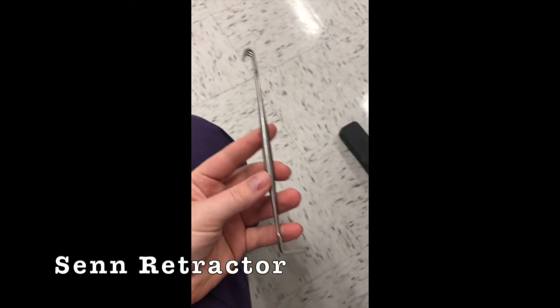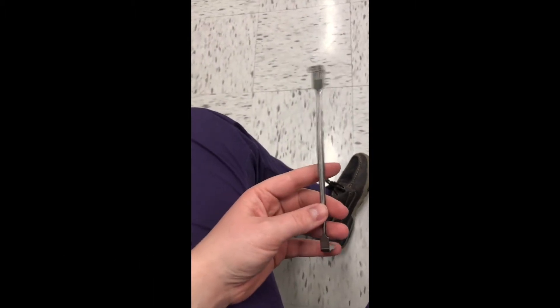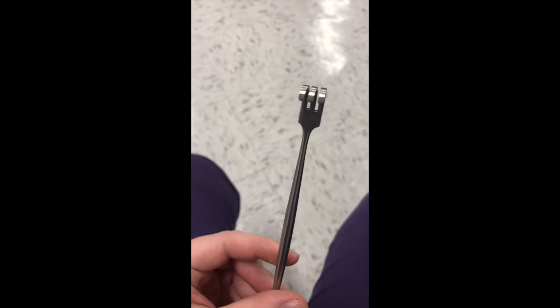And then the pokey one — what's this one? Senn. That's the non-pokey one. There's a sharp and a — there's a sharp one. The actual name: Senn-dull. And then there's a Senn-sharp, so there's the Senn-dull and the Senn-sharp.